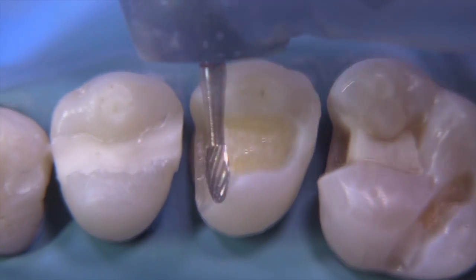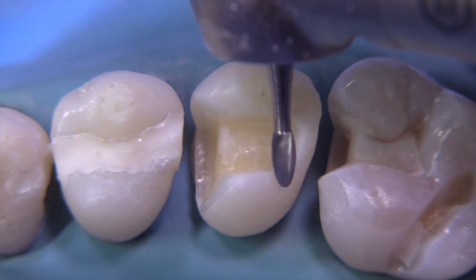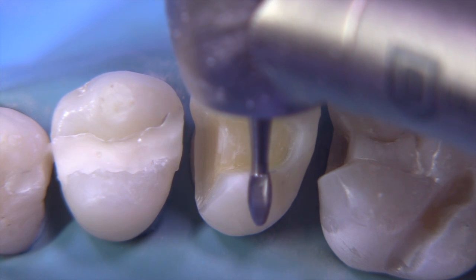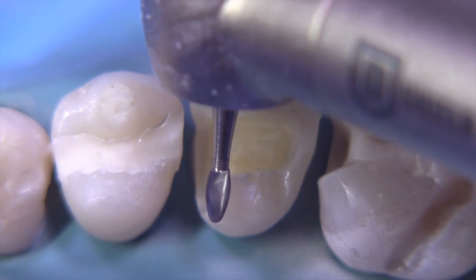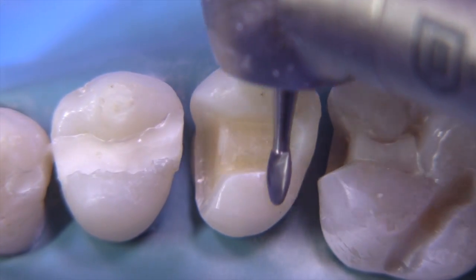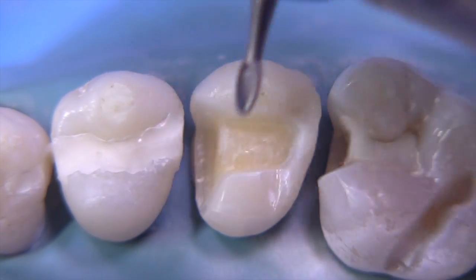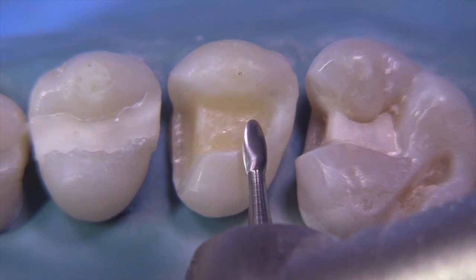So we have to make the call to onlay this. But how do you onlay an MO inlay without creating a distal box? We kind of showed you that in the second video in this series, but I'm going to show you here again. You can see that we start the preparation a little bit away from the marginal ridge, and then go ahead and create this A-plane — this functional cusp bevel first — and establish the outline form on the lingual. And then we're going to turn the instrument around and face towards the facial with the tip of the burr, and mimic the inclination of the adjacent premolar, and then perform the B-plane.